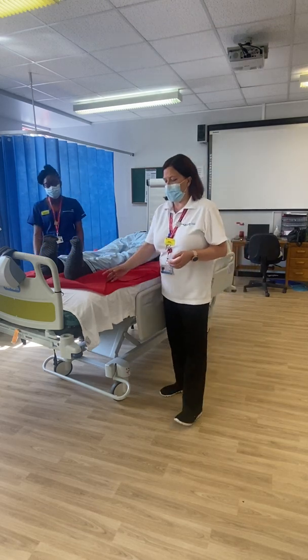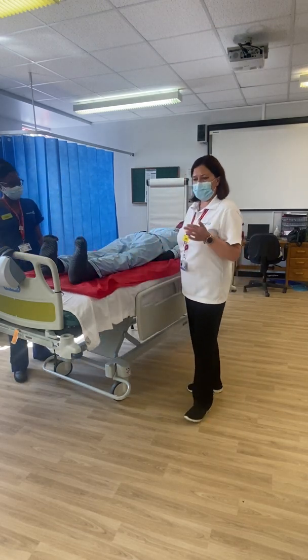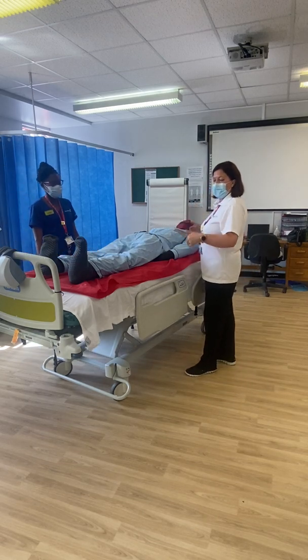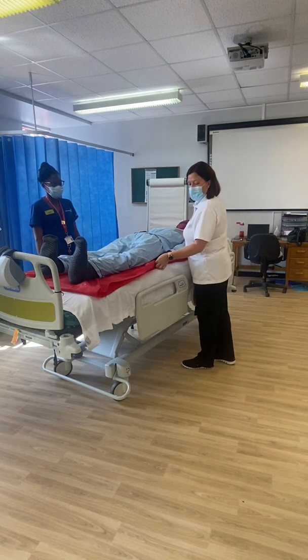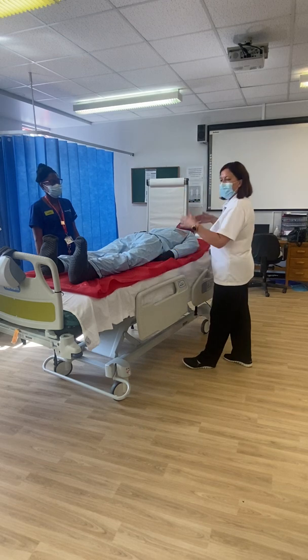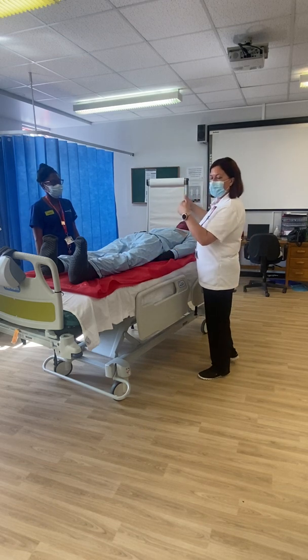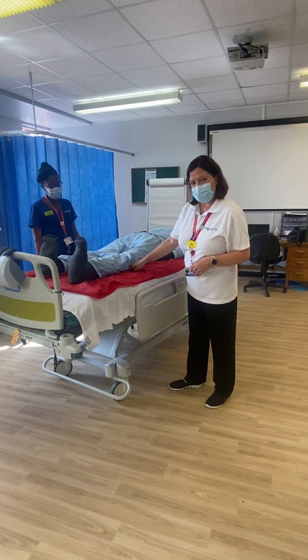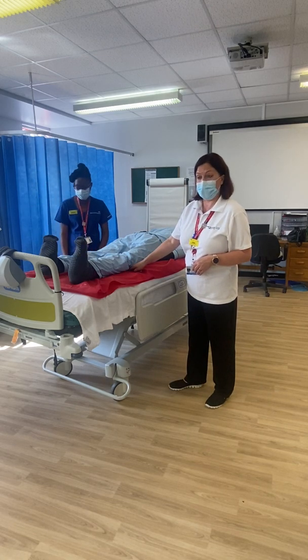In order to take the slide sheet out, we can use two methods. We can either roll the patient as we did before, in which case we would roll the patient, tuck the slide sheet up underneath them, roll them back, and then take it out that way. Or there is a natural gap that occurs underneath the patient's knees when they're lying flat.